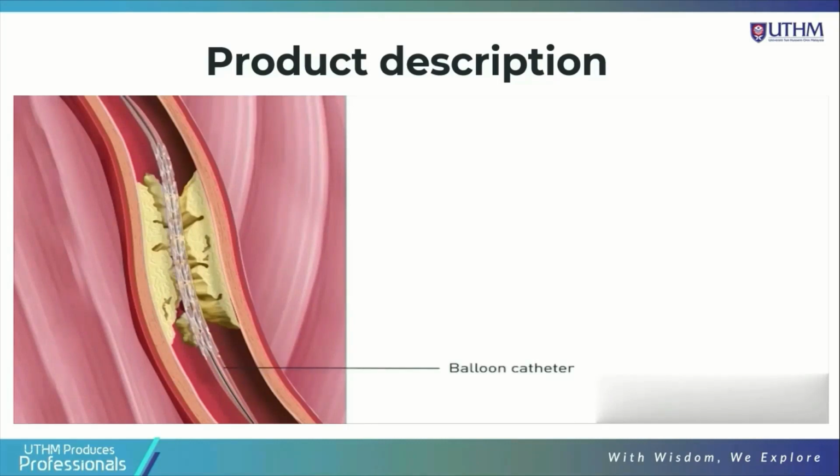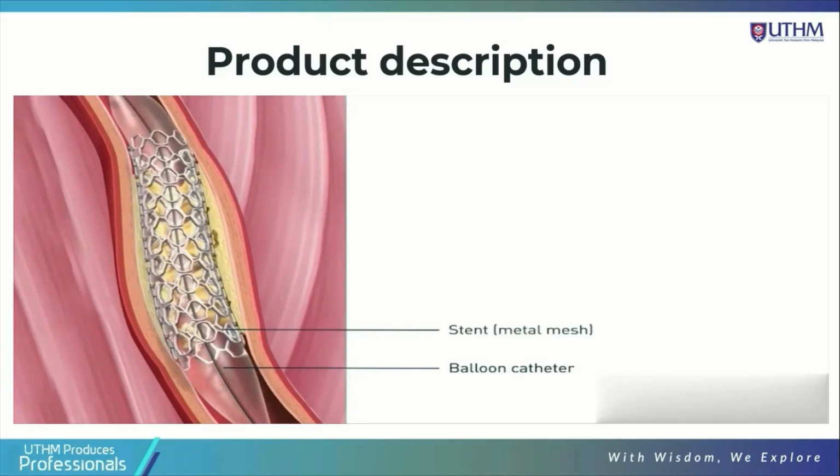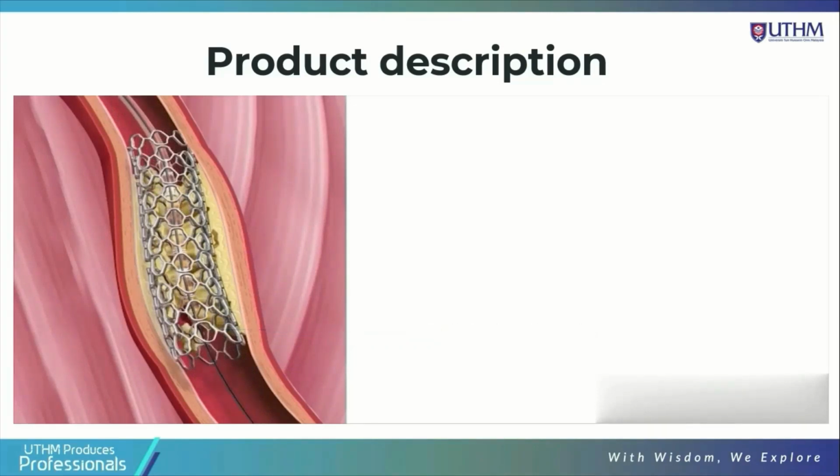The experts predicted that the stent strut geometry had a major contribution to the restenosis process. Stent strut geometry plays such a key role in the restenosis process and has a relationship with the velocity, pressure, and wall shear stress distribution near the stent strut geometry.